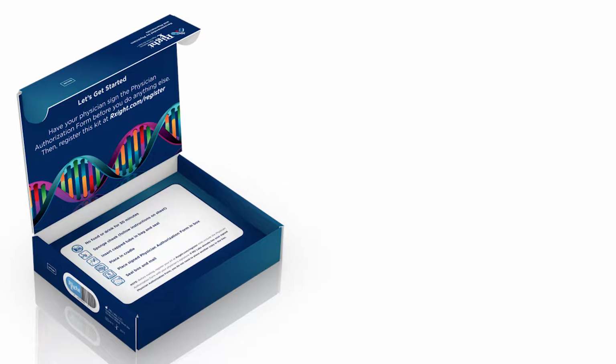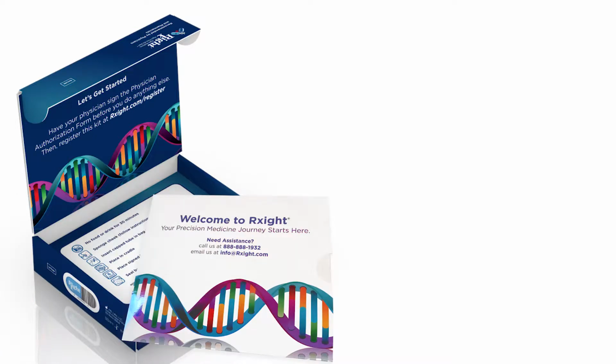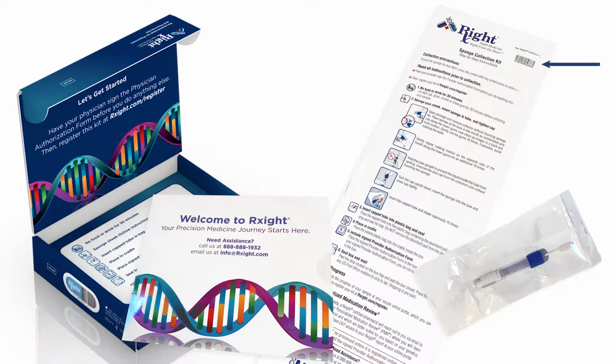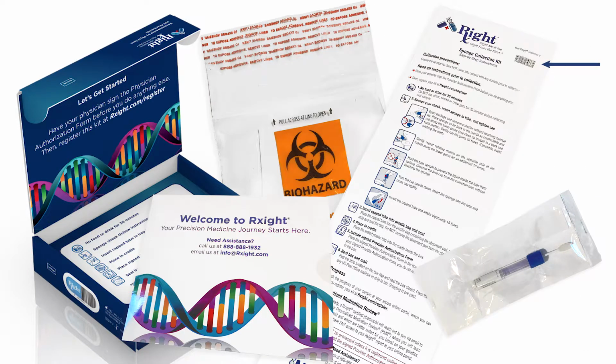When you open the box, you will notice several components. First is a welcome pouch, which contains step-by-step instructions with the lab requisition number sticker affixed in the upper right-hand corner, an Rxight DNA collection sponge, and a specimen bag.